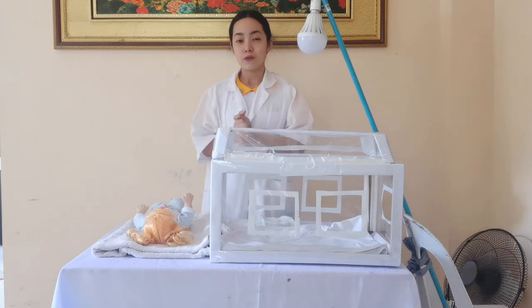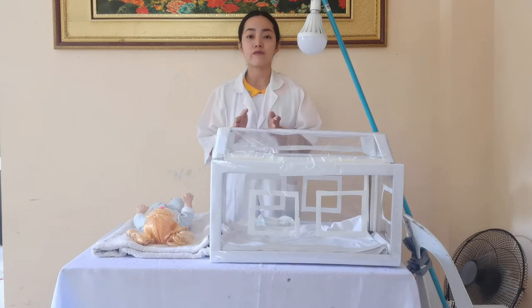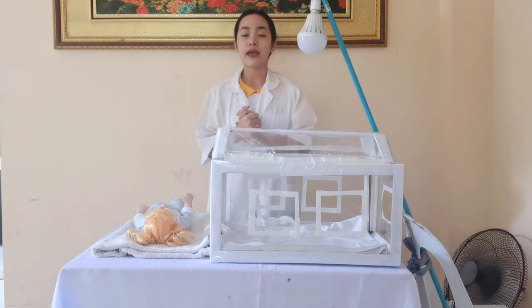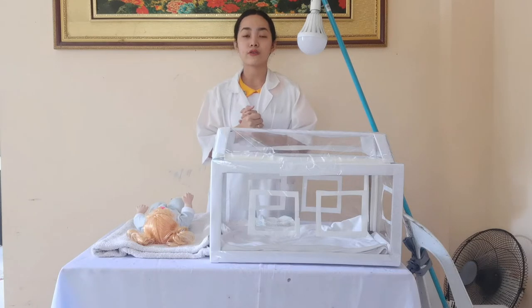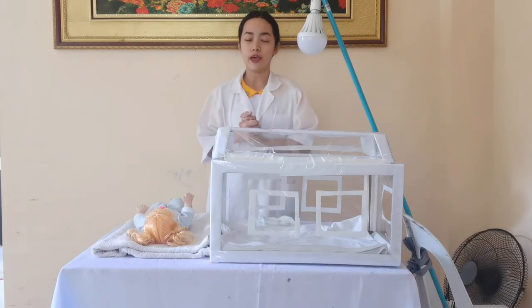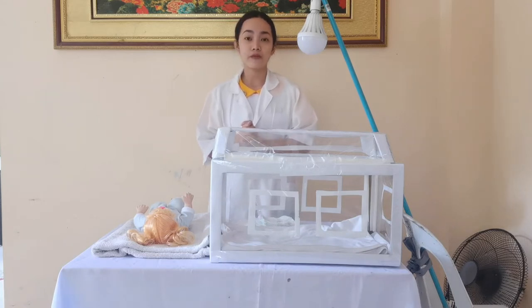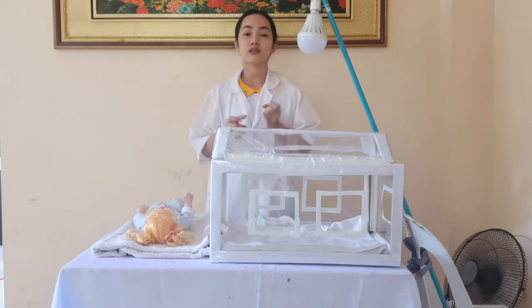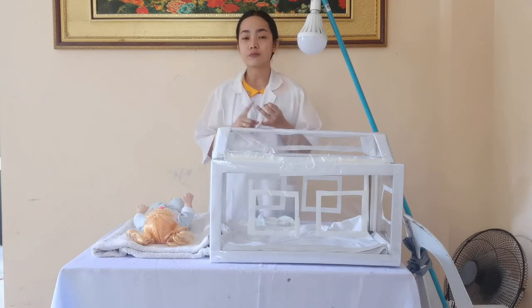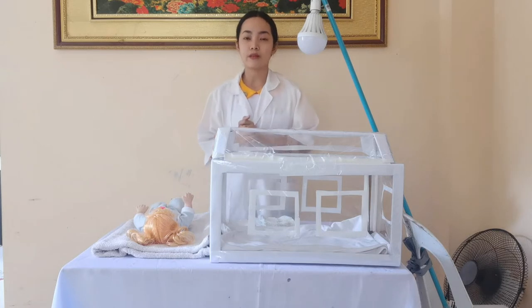We also have to check the weight of the infant once daily while the phototherapy is ongoing, and monitor the urine and stool output of the baby, taking note of any changes. We also have to check for the side effects of phototherapy, which include transient skin rashes, bronze baby syndrome, loose greenish stool, and increased metabolic rate.